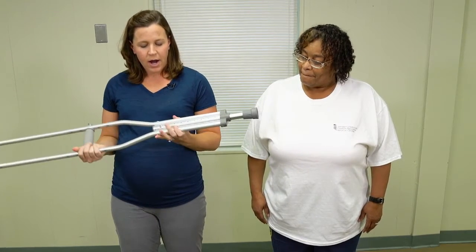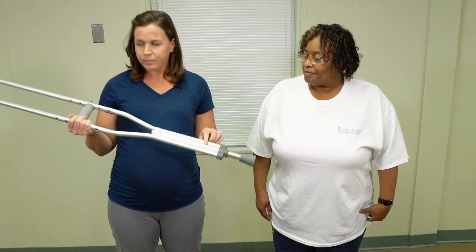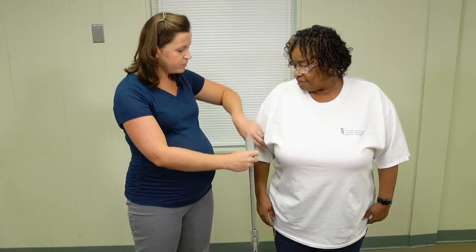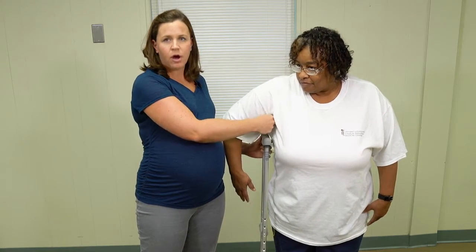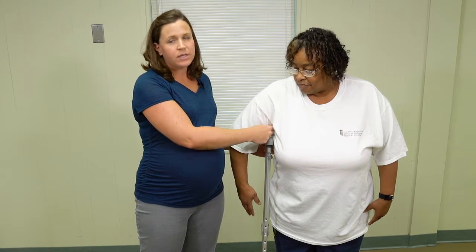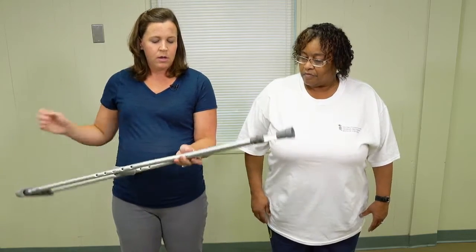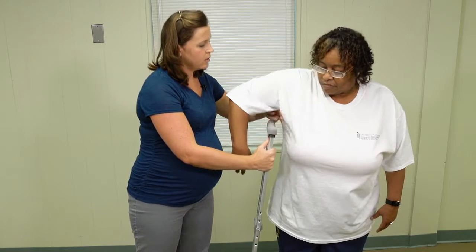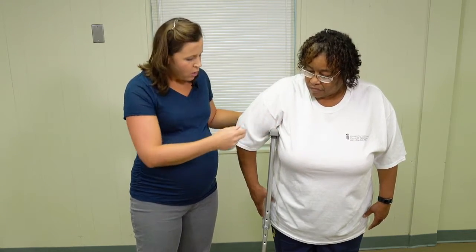I am 4'11", ma'am. 4'11". There are height measurements down on the bottom of the crutch. Use that as a guideline. When you have the crutch height adjusted, there should be about a 2-finger space between the top and the armpit of the patient. So here you can see that this crutch will have to go up a little bit higher for the patient. Again, it should just be about 2 fingers space.